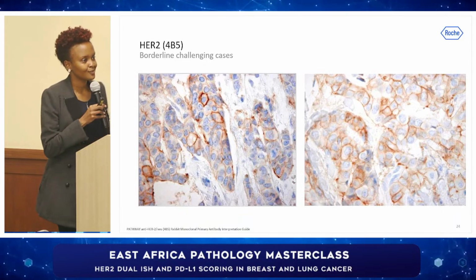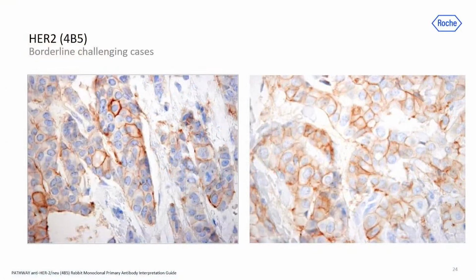Anyone? You'd go 2+ on this. And the second one? So, 2+ for both of them.